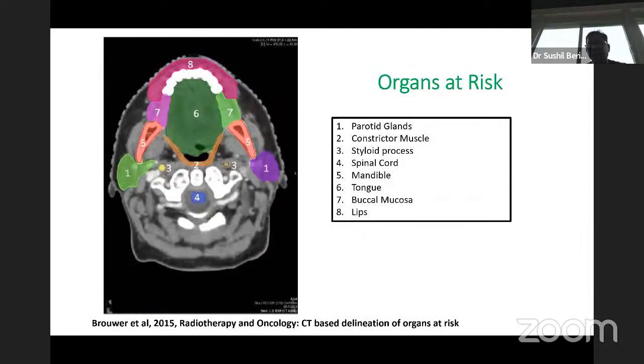So switching gears from the GTV, CTV, and PTV, let us switch gears to the organs at risk. So I asked the question: what is the tolerance of the spinal cord? And one of the listeners said 45 gray. Spinal cord tolerance is not 45 gray. The tolerance concept came from the old concept that there is a 5% probability of grade 3 complication with the dose.